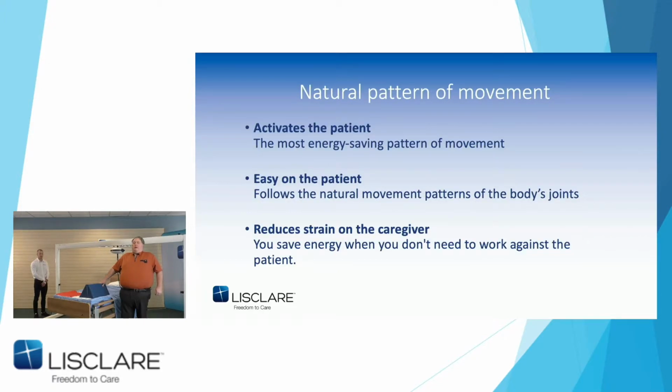Now, these are the principles of natural pattern of movement and why it works so well. It activates the patient, which is great. It's easy on the patient, and it reduces the strain to the caregiver, which everybody's a winner in this case.